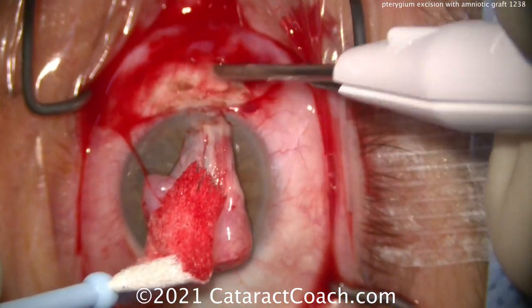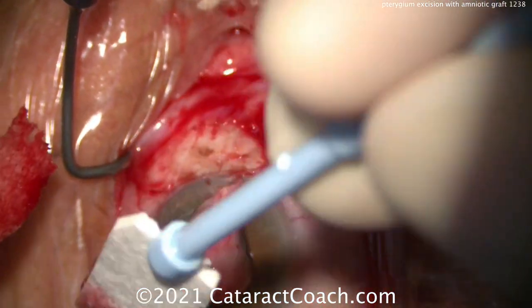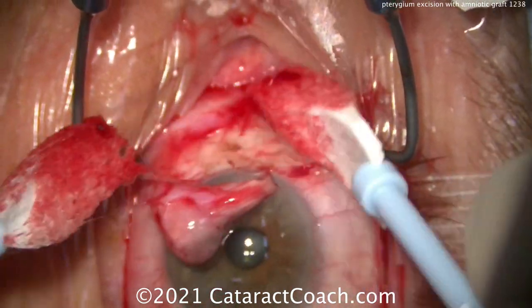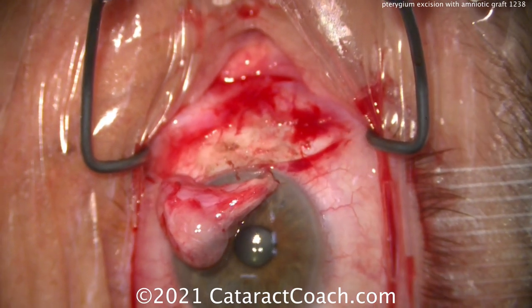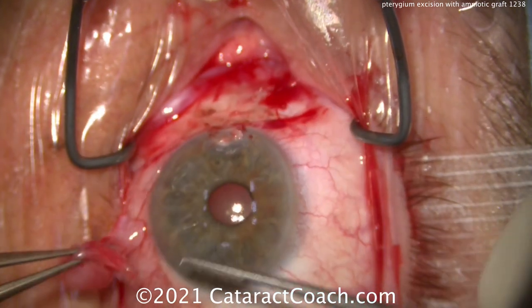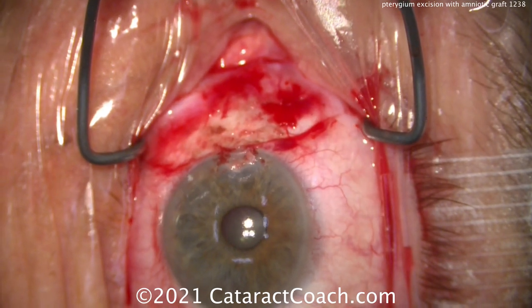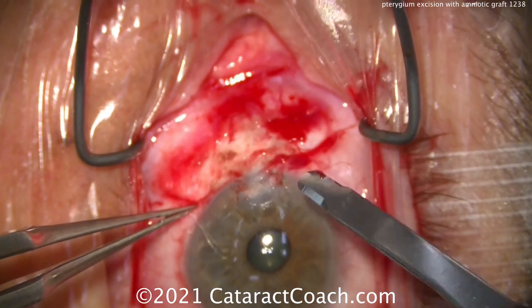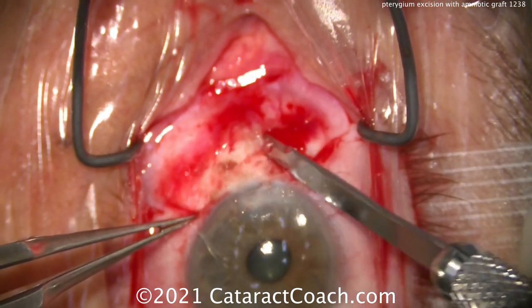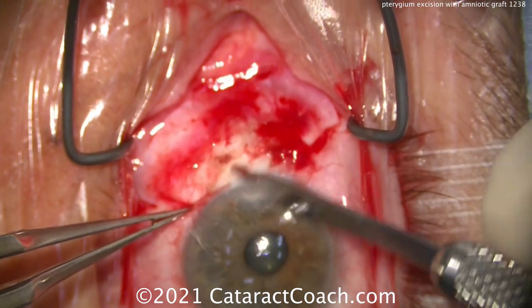Now we're just cleaning that up nicely. You can see the pterygium already — we've cut the blood supply off, and it already wants to peel off by itself, so that'll come off pretty easily. You can dissect further back and try to get the tentacles of the pterygium as well, but again, be very cautious of that medial rectus muscle — it's a lot closer than you think. Just using a couple of forceps, you can peel it right off the cornea without sharp dissection. We can use a crescent blade or 69 blade to help smooth off that surface and remove any little bits of material, and we can also use a burr to smooth that out.